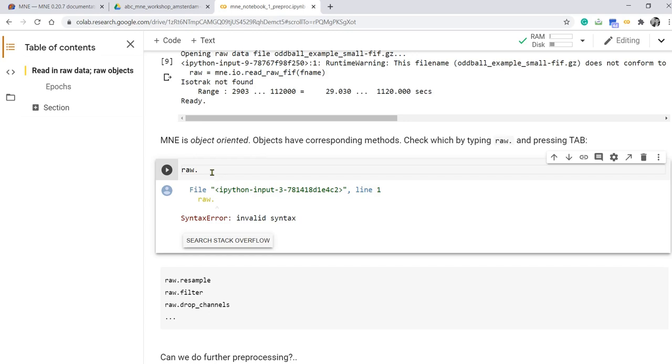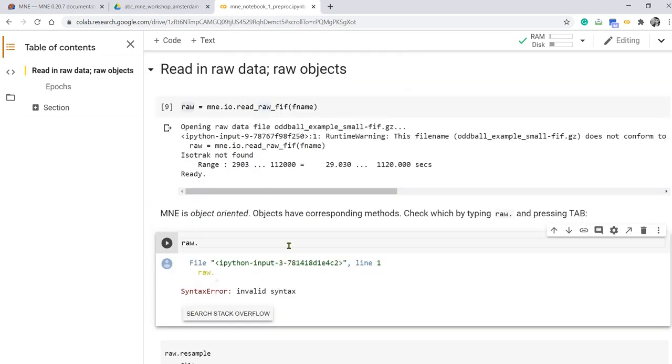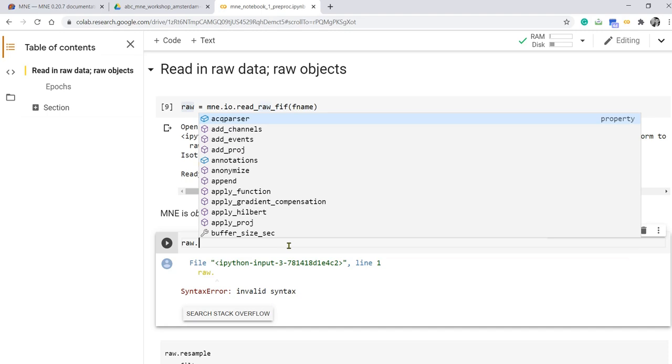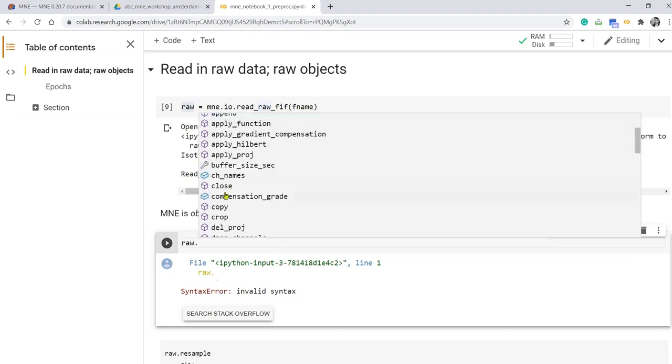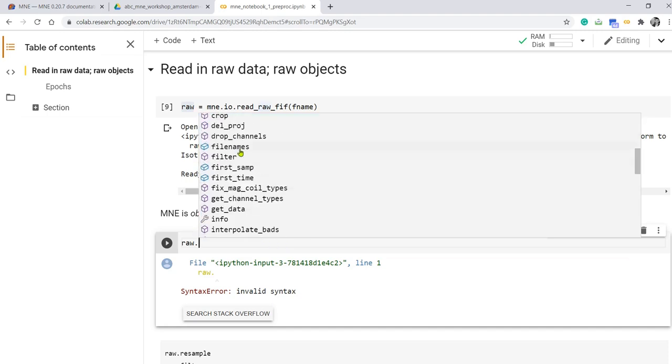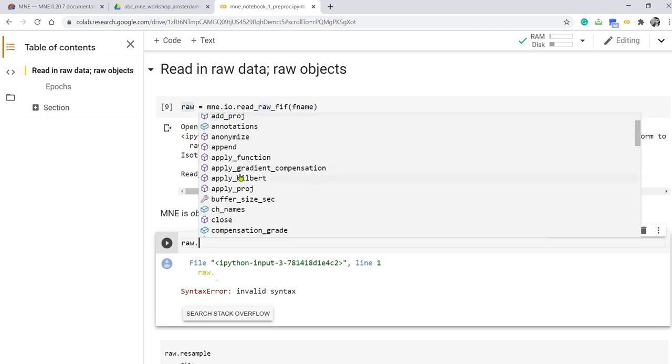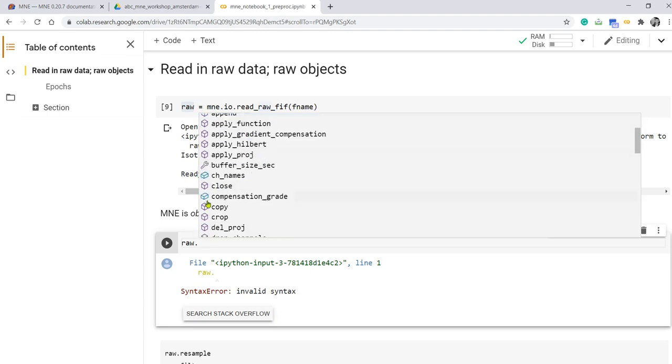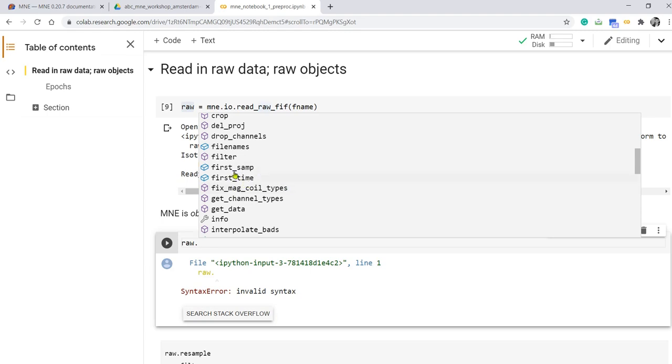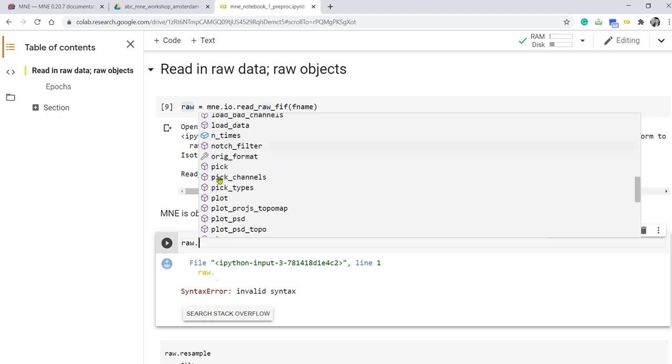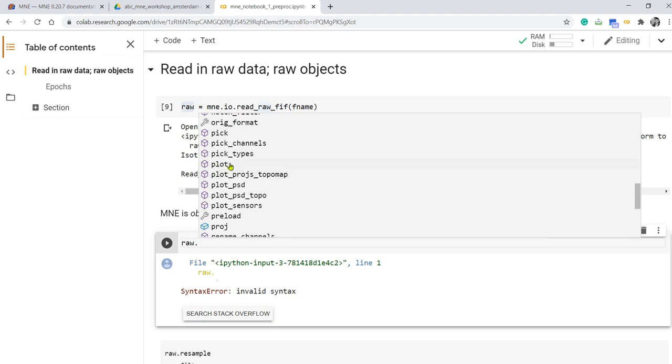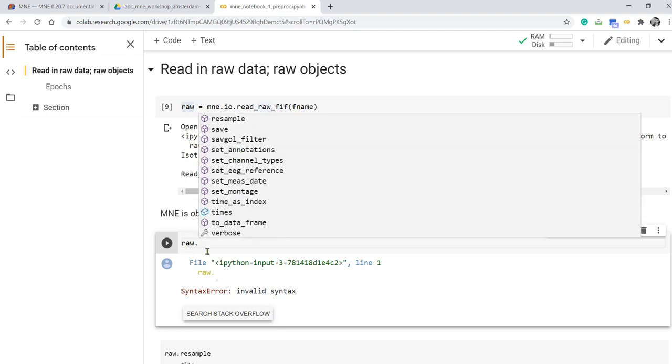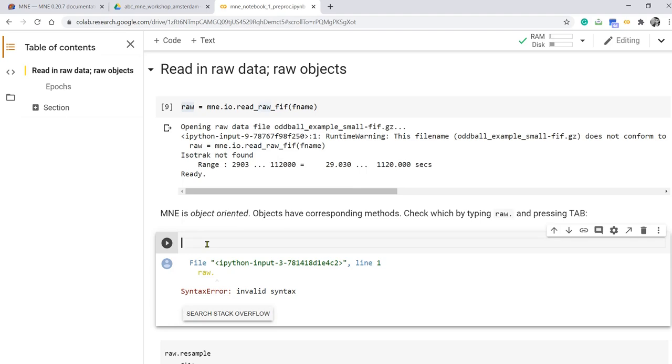So MNE is object-oriented, Python-based toolbox or tool or library. Therefore, every object in Python has their corresponding methods. So to access what you can do with this object, you just can do a few things. So first we'll raw and then tab. It shows different methods coupled with the object, encapsulated. So raw is now continuous EEG data. What we can do is add channels, events, remove, append, crop, copy, drop channels. We can also use filter, perform some band-pass filtering, and many other things. Plot. Another widely used function. Save. So I highly recommend you to explore those functions just to learn.